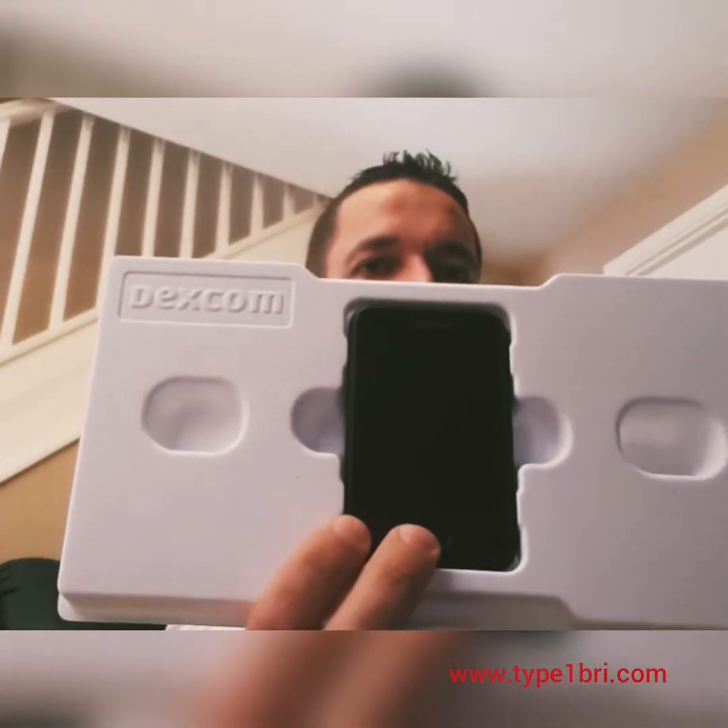But it's always good to have the receiver as well. When you unbox it, you've got a nice little receiver which is quite sleek and low profile — fits easily in your pocket. It's quite nice.